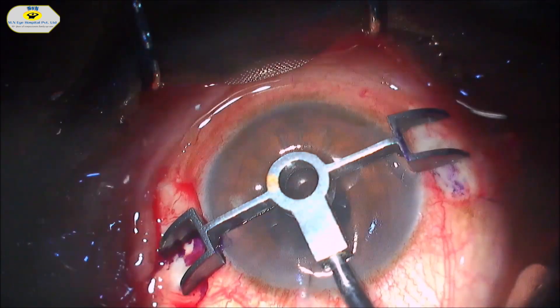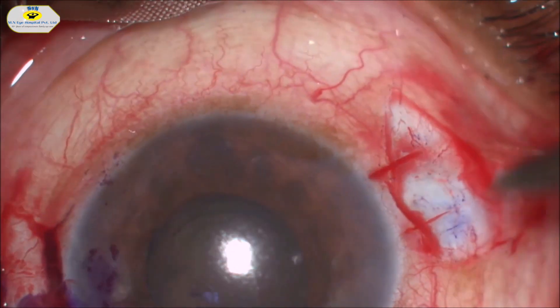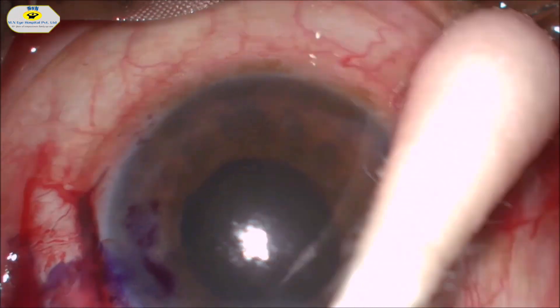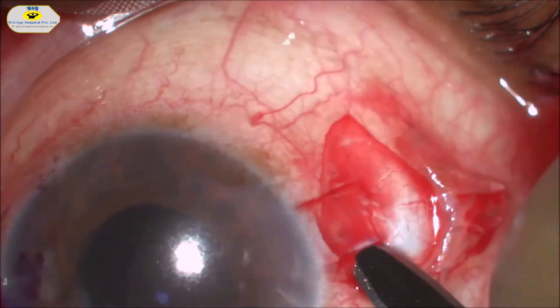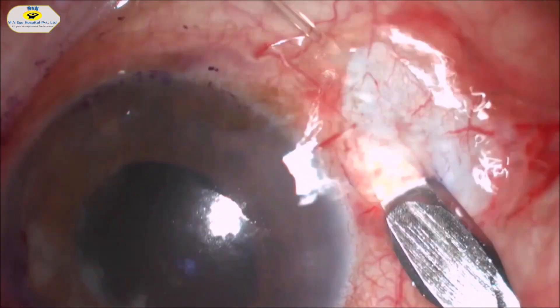Ashwin's glued IOL marker is used to create the site of the scleral flaps at 0 and 180 degrees. 2.5 by 2.5 mm partial thickness scleral flaps are created with a crescent blade on either side.